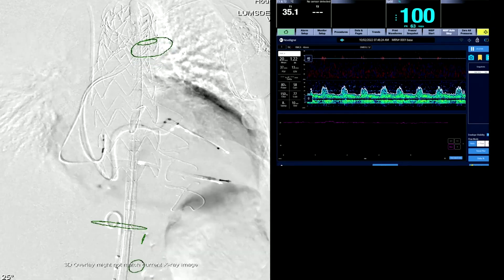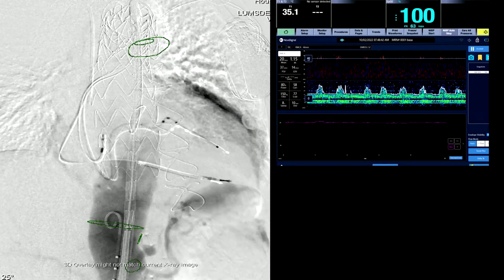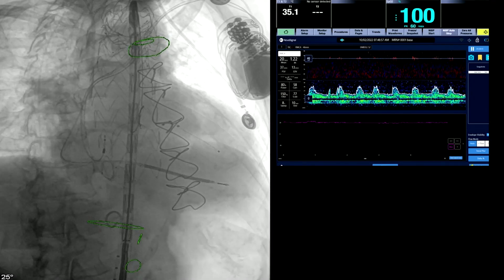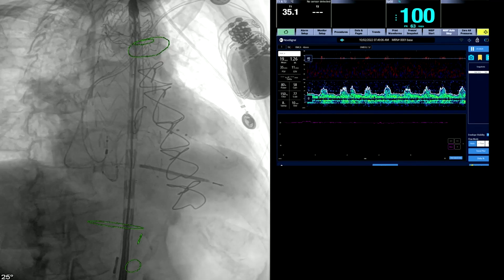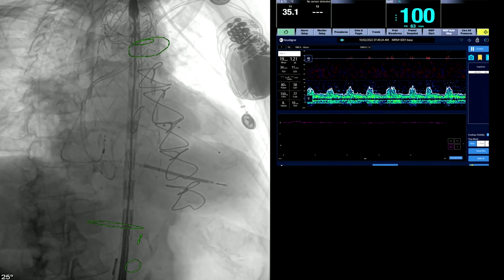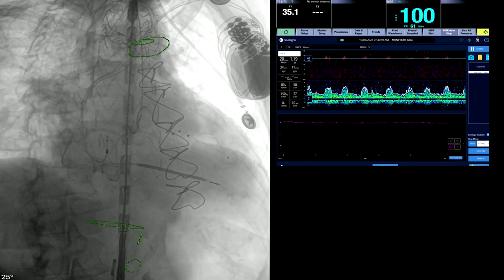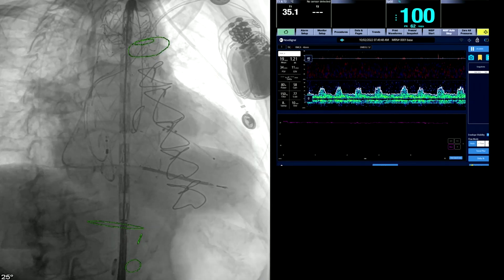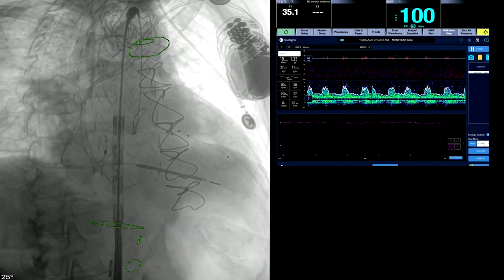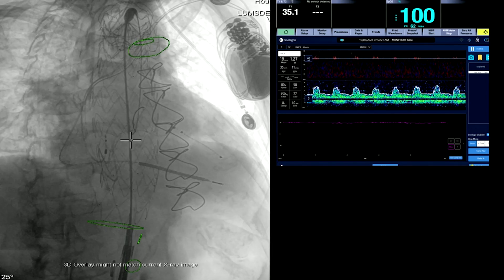This is an RAO position, all determined preoperatively based on how we're going to deploy this. At this point all you really care about is the bottom end. You need to know what the celiac origin is, and focus on that as you stabilize the grey pusher and withdraw the sheath to allow deployment. You're continuously adjusting — the device tends to be pushed down. Now you can see the device being deployed. The nice thing about this graft is it deploys very accurately.